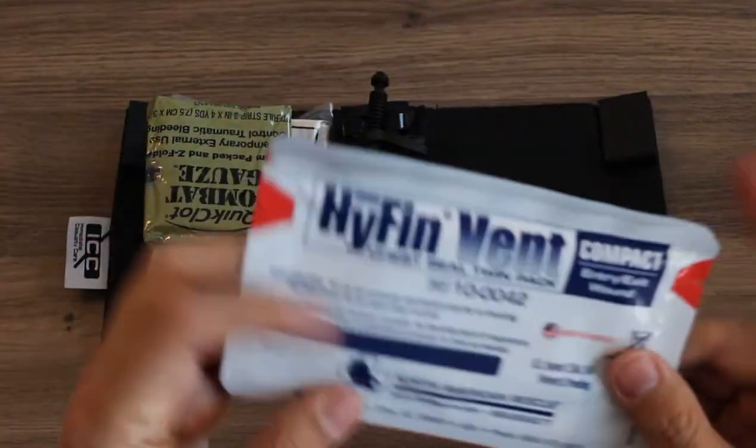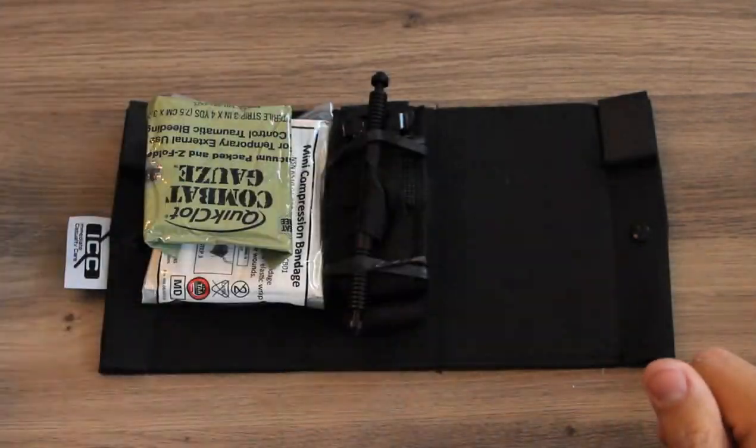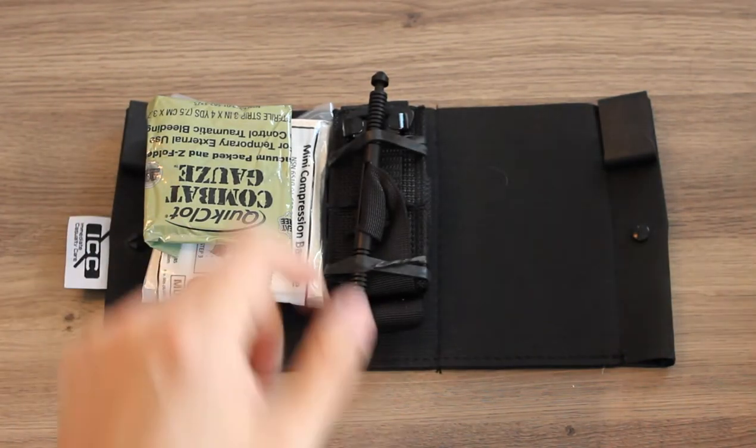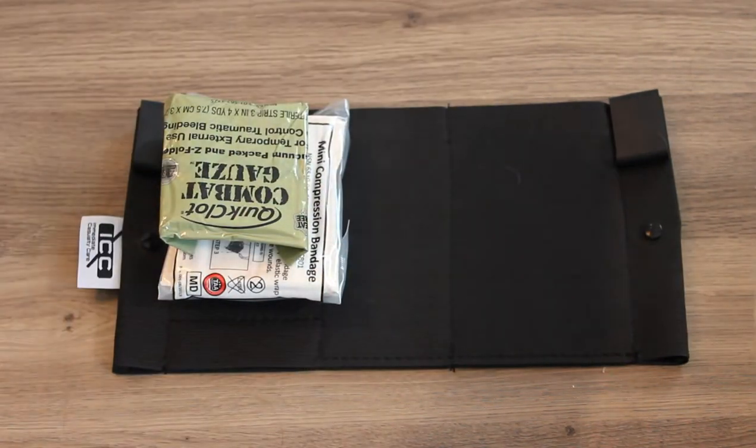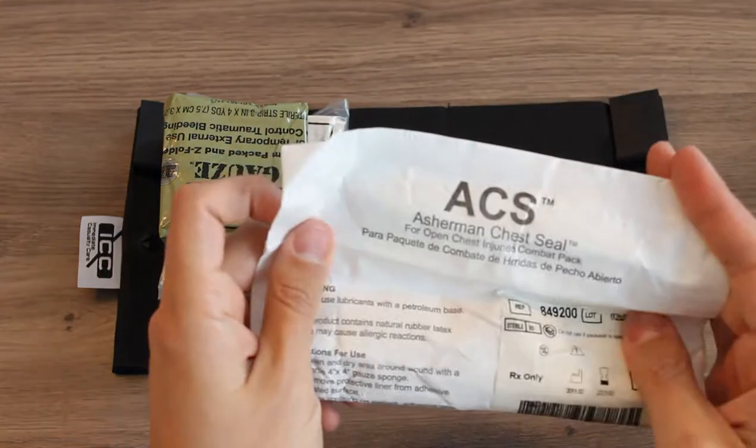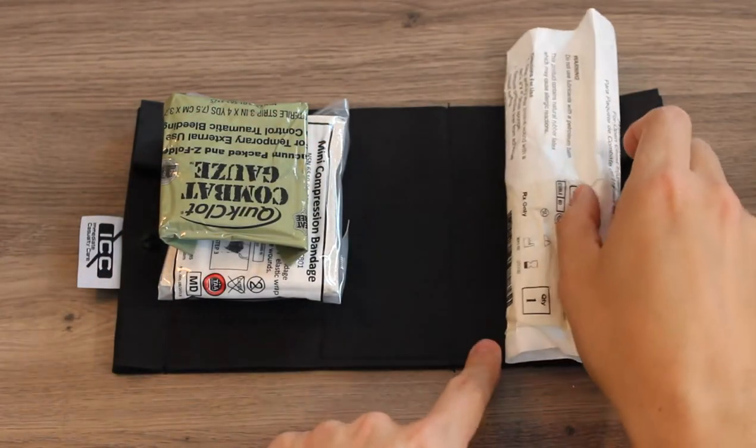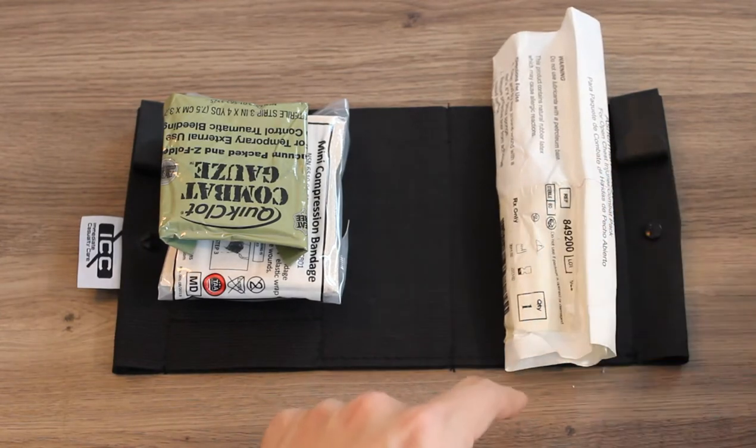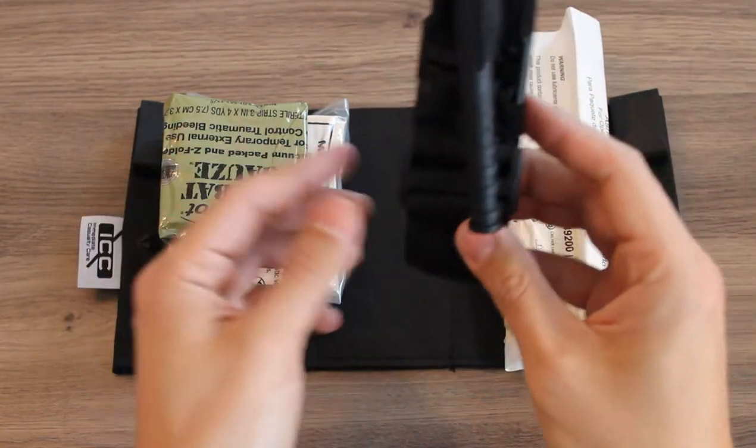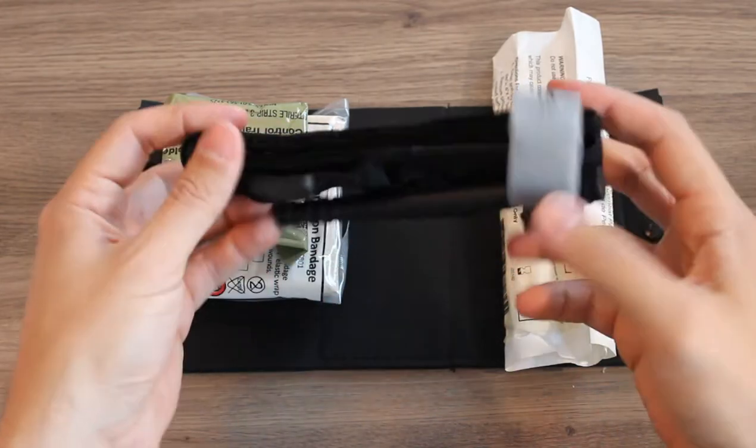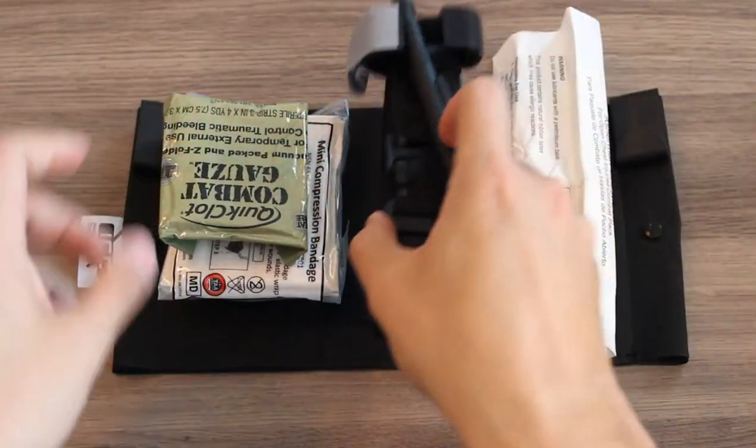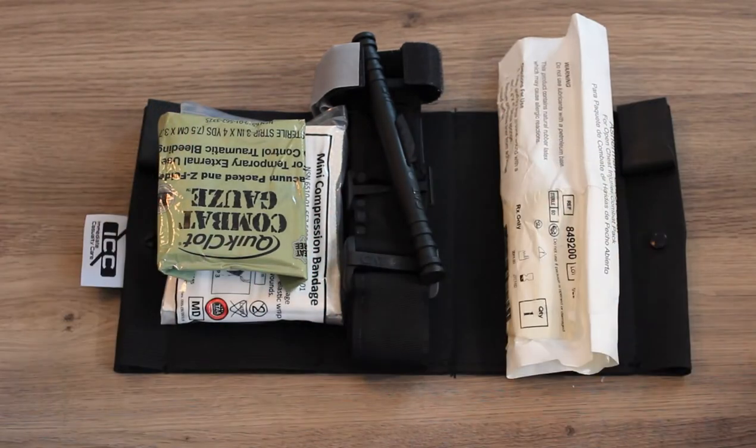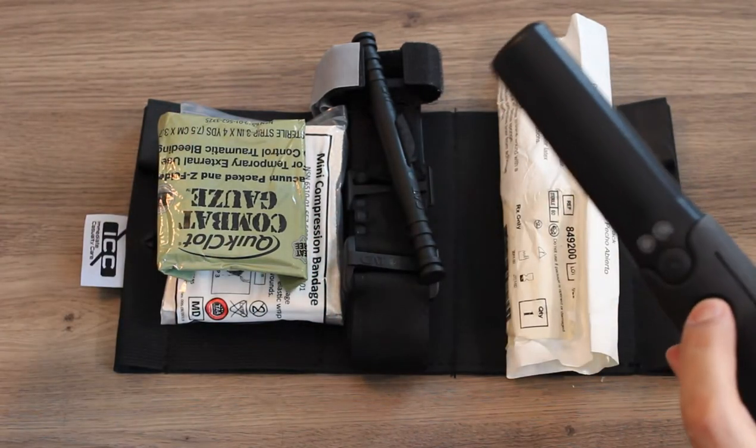You can place an Asherman or a CAT tourniquet in the system if you'd like, and you can make this completely non-metallic at that point, giving you better operational capabilities in a non-permissive environment. Here we have the CAT Gen 9, and now we have a completely non-metallic system.